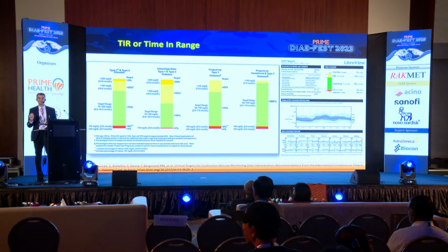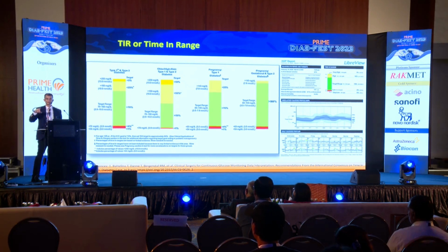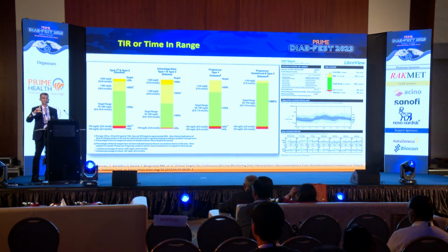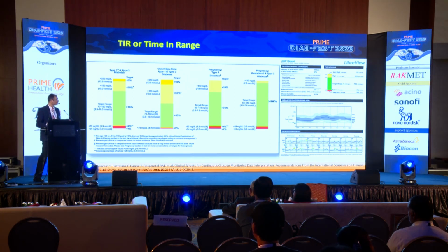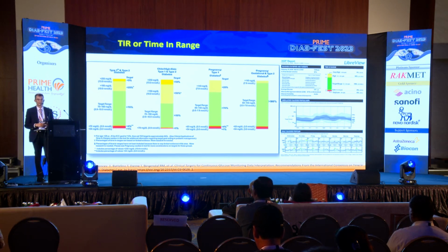So these are the TIR ranges for different people. If you see here, for type 1 and type 2 diabetes patients, most of them, their TIR, the green bar, which you can see on the left side in the menu, in the sensor, when you are using it on your app, more than 70% of the time your level should be in green. That means you are within range. Then if there is an older person or a high-risk person, then more than 50% of the time. Pregnancy with type 1 diabetes, more than 70%, but with pregnancy type 2 and gestational diabetes, the TIR should be more than 90%. And if you see here, this is the graph. You should not have too much up and down in this, and the variation should be less than 36-37%. So if you are going like this, that means there is too much variation, which is not good for your health.